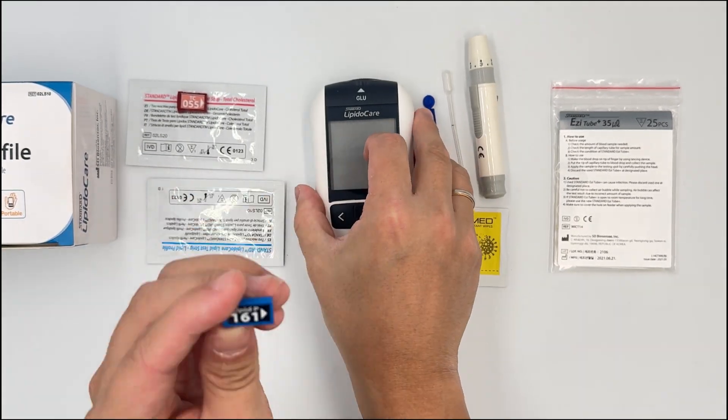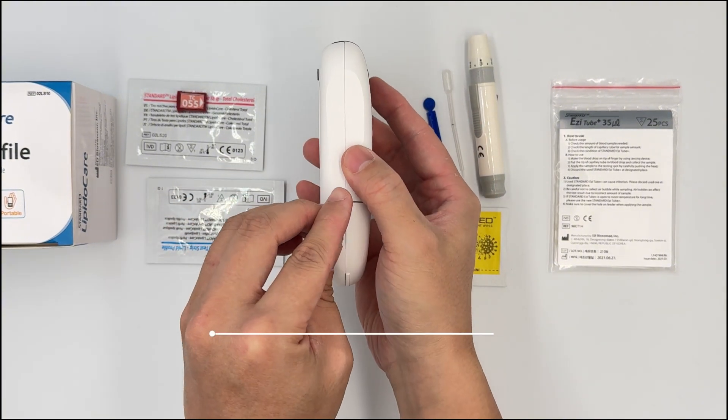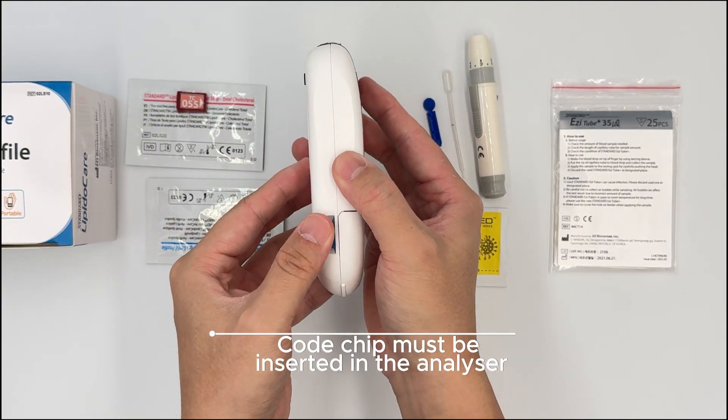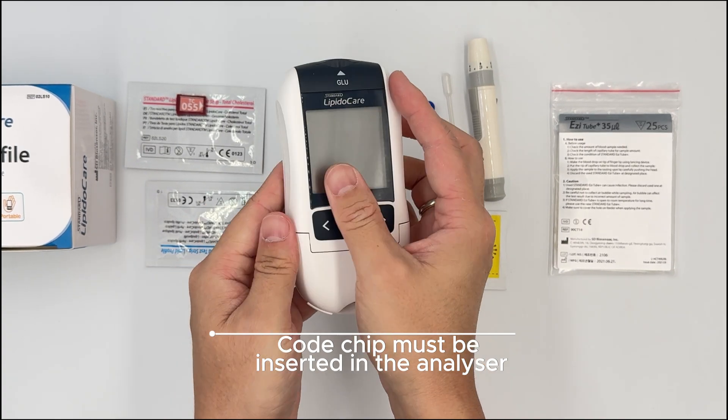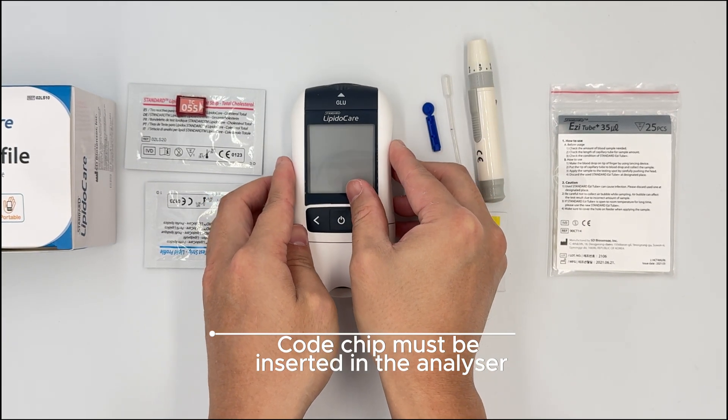Next, take the code chip and put it into the side of the meter and push it until you hear a click. Then you will be ready to do the test.